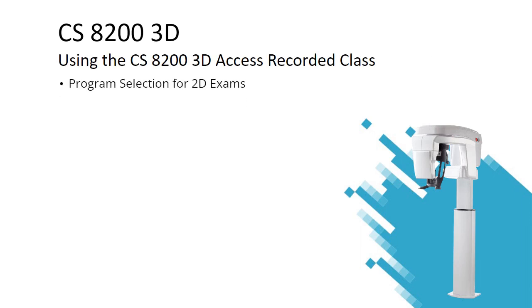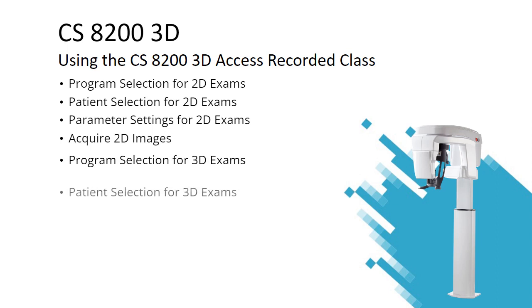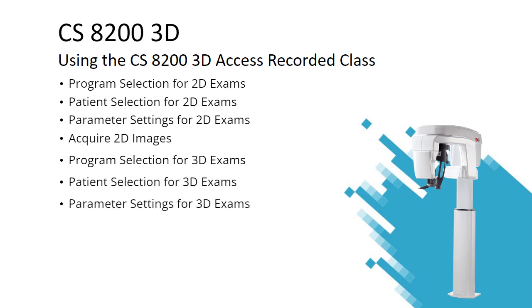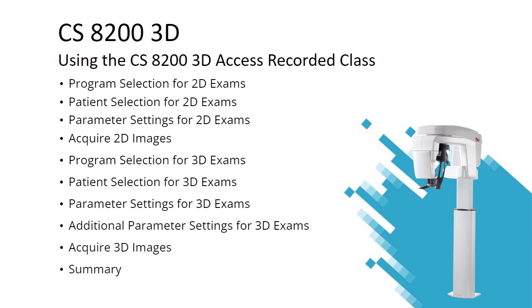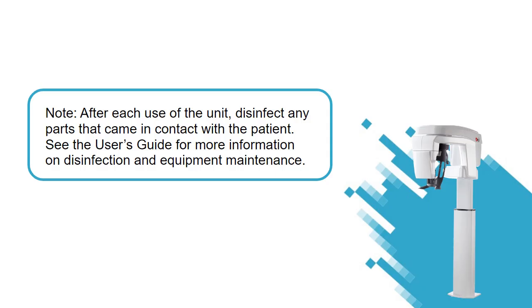CS8200 3D – Using the CS8200 3D Access System. This recorded class is designed for clinical team members and demonstrates how to acquire images using the CS8200 3D Access System. The CS8200 3D Access is designed to capture 2D panoramic images, 3D CBCT images, cephalometric images, and 3D model scanning images. Be aware that after each use of the unit, you must disinfect any parts that came into contact with the patient. See the user's guide for more information on disinfection and equipment maintenance.